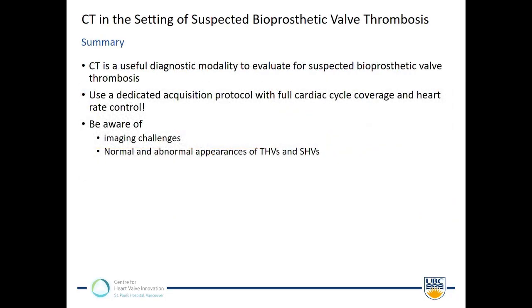So in summary, I think CT is a very useful diagnostic modality in patients with suspected prosthetic valve thrombosis. It really helps to identify how many leaflets are involved, what the severity is, and of course the differential diagnosis. It's important to employ a dedicated acquisition protocol. I would cover the entire cardiac cycle, and most importantly, perform heart rate control, especially if you're using a single source system. And then, of course, be aware of the normal and abnormal appearances of different valve types. Thank you very much for your attention.